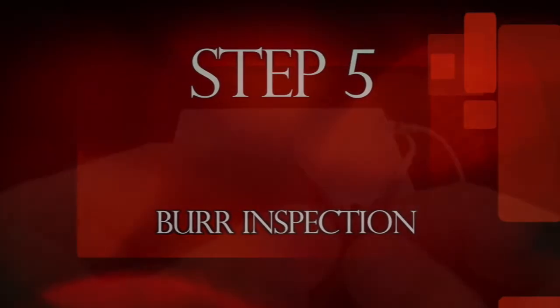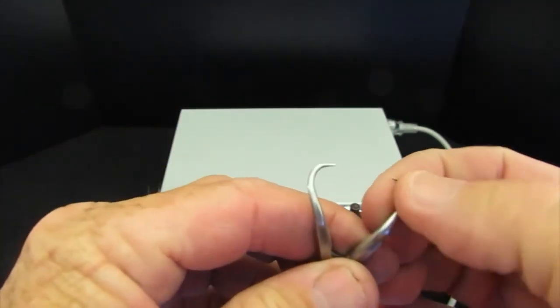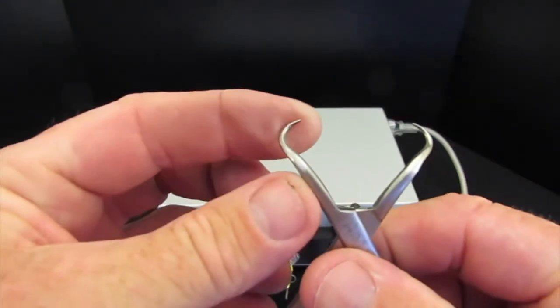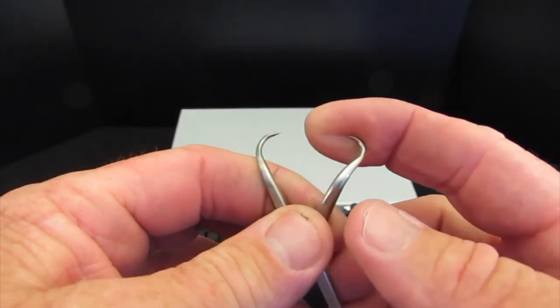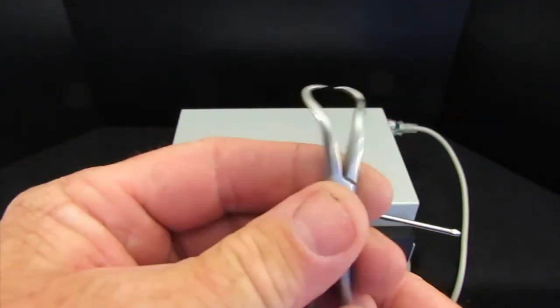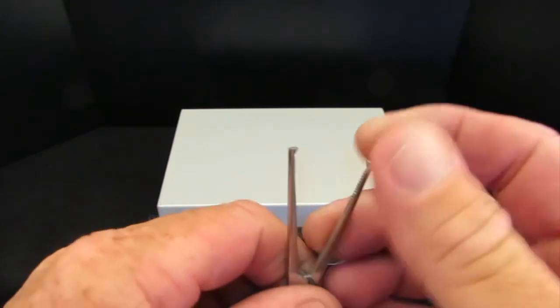Burrs are sharp distortions in the metal that can cause an instrument to malfunction. Carefully visually inspect the sharp points on towel clips and the tips of ring-handled forceps. Microburrs can best be discovered by carefully feeling the surface of the instrument with your fingers.